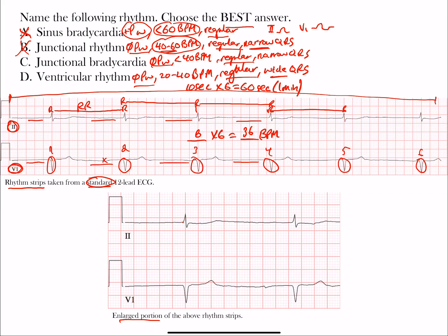Looking at the QRS complexes, from beginning to end they are less than 120 milliseconds — these are narrow QRS complexes. That's the key differentiator: narrow QRS rules out ventricular rhythm, which requires wide QRS complexes. So despite the rate of 36 bpm falling in the ventricular rhythm range and the rhythm being regular, this is not a ventricular rhythm.